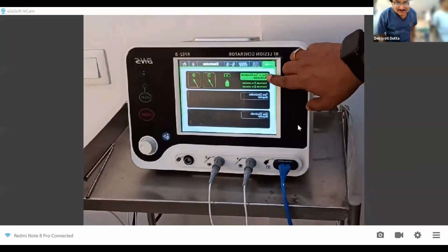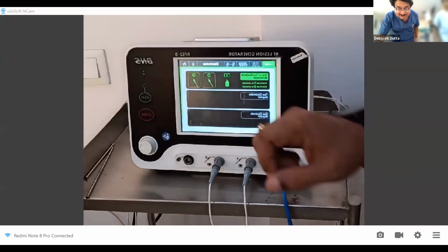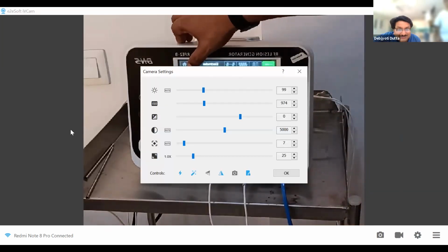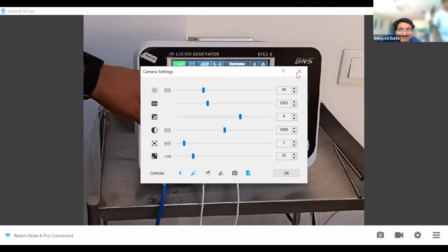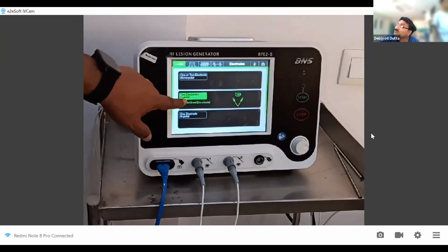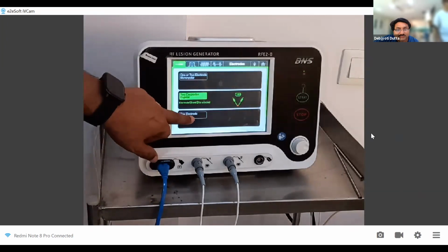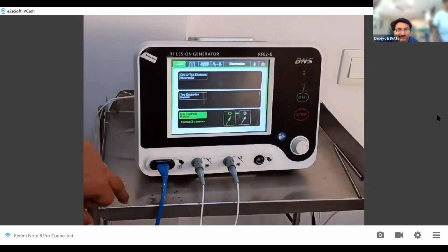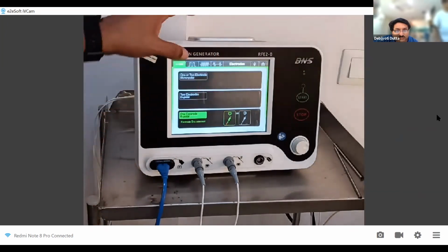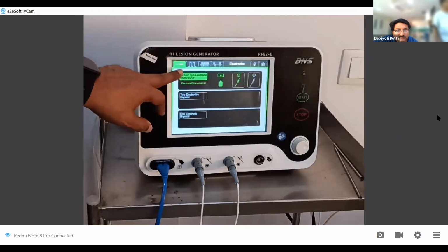What we can do is 1 or 2 electrode monopolar. Monopolar with 2 electrodes means it is multi-channel, meaning 2 monopolar lesions made together simultaneously. I told you that is another mode of how we can use it. The second mode is 2 electrode bipolar. Here there will be 2 electrodes, but bipolar, and there can be 1 electrode bipolar, meaning the circuit will be completed between the 2 needles, but the lesion will be only at one electrode. So these are the different kinds. Most commonly we do 1 or 2 electrode monopolar.